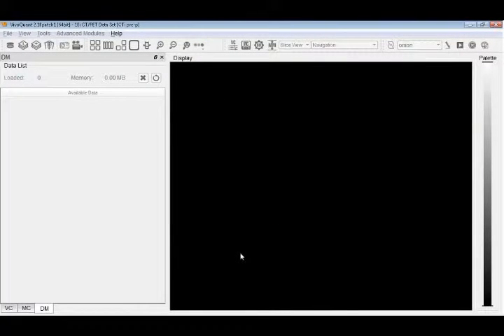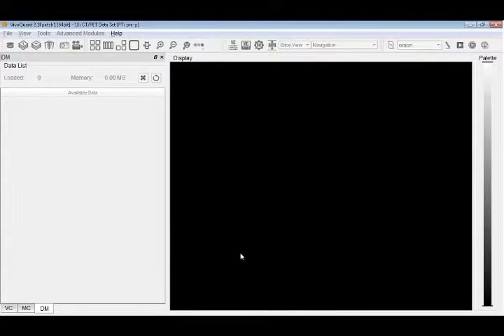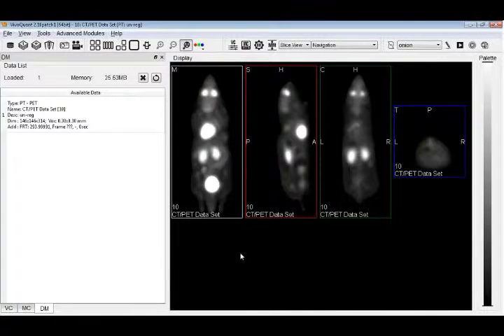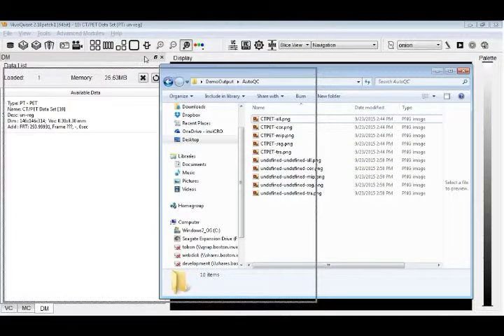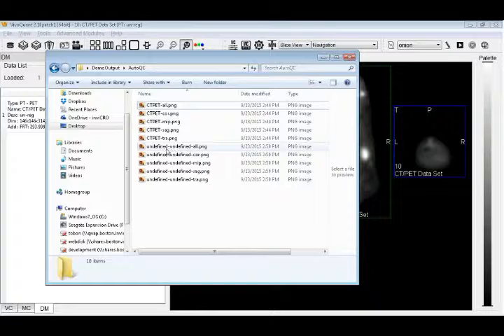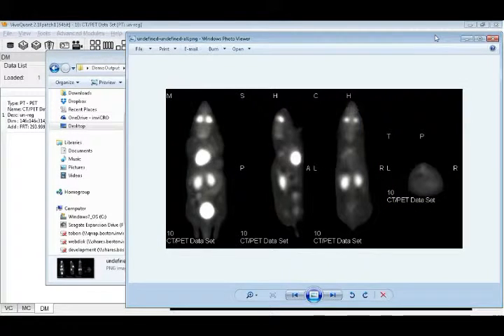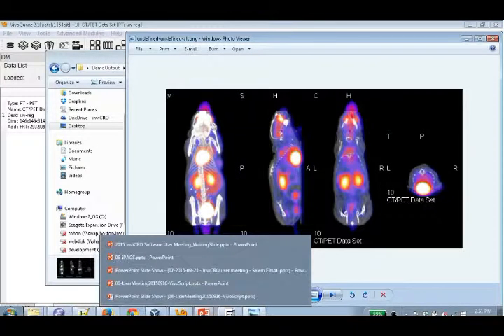Okay, I only loaded one CT data set. I'll load one PET data set, and then another PET data set, so that's looking pretty promising. Let's see what that looks like. Our names are all messed up. So I obviously referenced those things wrong. Let me see. So for one thing, undefined is by default what you get in JavaScript if those objects didn't compute properly. So they got overwritten with the very last pet, which is kind of what you expect.